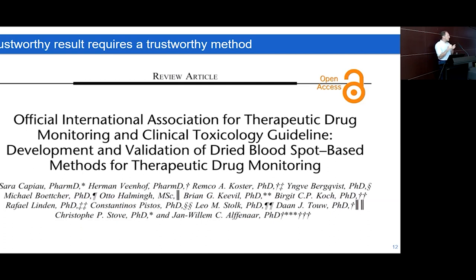This comes down to the fact that an intensely dried blood spot may be more difficult to extract an analyte from than a freshly dried spot. In other words, if you have two spots, and that's the exact experiment that we do quite early on, we prepare replicate spots. One we just put at room temperature, the other we put at 50 degrees for 2 days. The one that has been stored at 50 degrees for 2 days will be entirely brown, because of the hemoglobin, which has changed in color. That one has been really intensely dried.